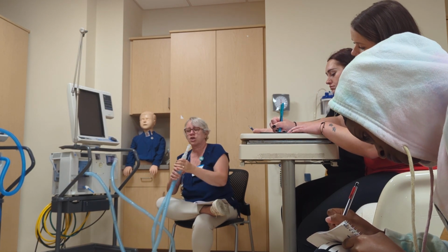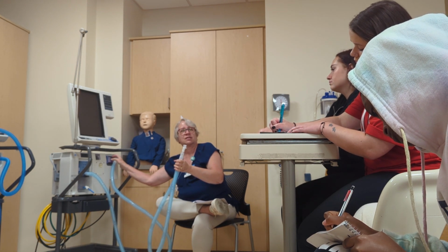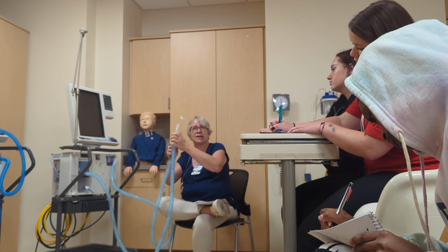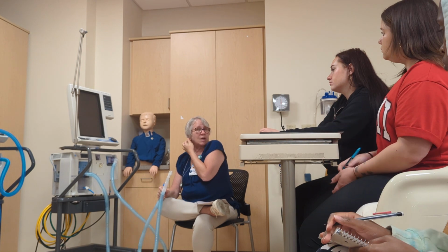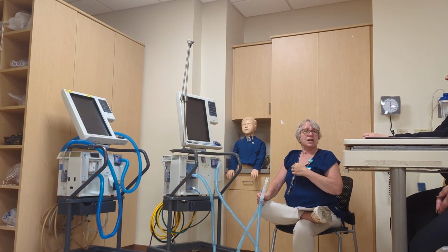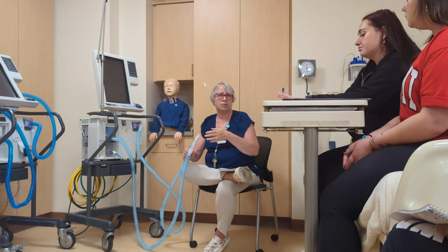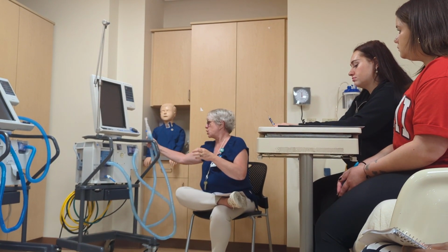With the circuit, you would always start tightening your connections, starting at the ventilator, working your way through the inspiratory side and back, okay? Your patient leaks because maybe you have not inflated their cuff, maybe their cuff is blown, maybe they have chest tubes in, so we'll look at how to troubleshoot that probably the next week or two, okay? So that is your patient circuit.